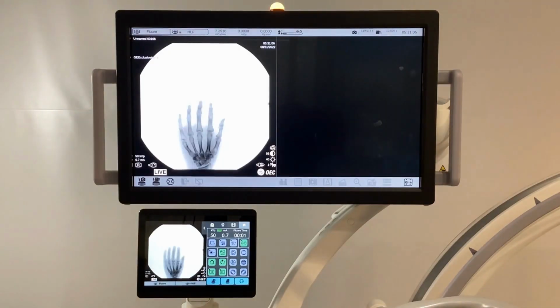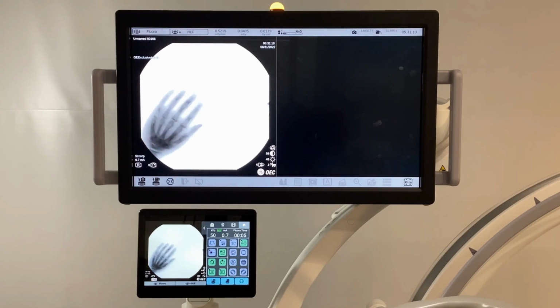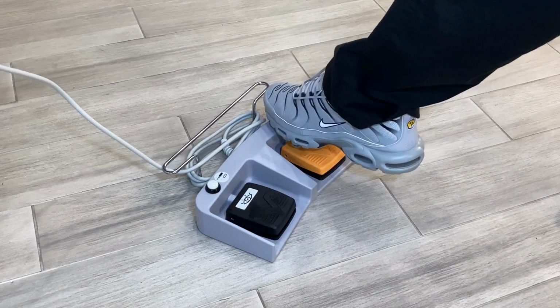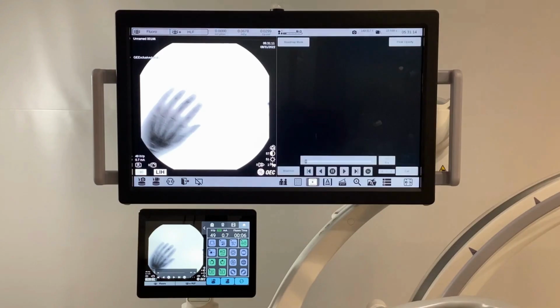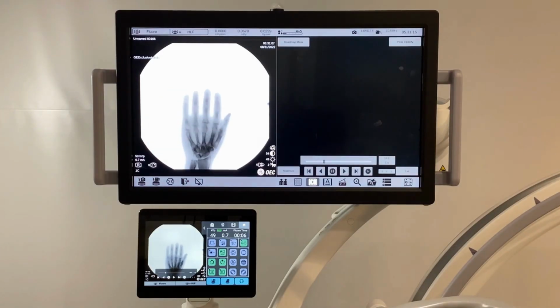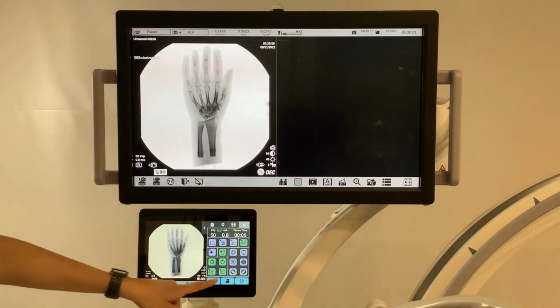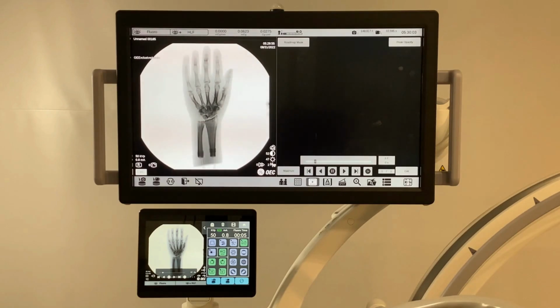This may include an injection or movement. Once terminated, on the foot switch, a long step on the Save button will activate Fluorostore. This will save up to 240 frames. Fluorostore is accessed on the right corner of the OEC Touch Control panel.